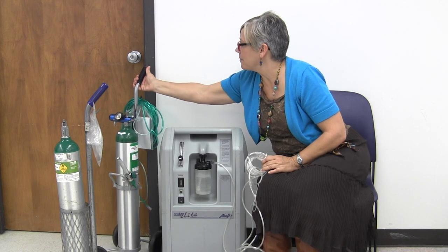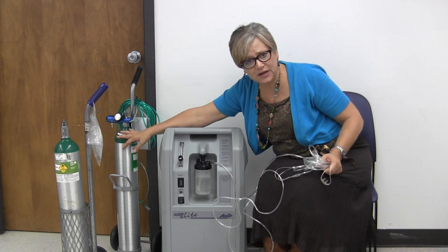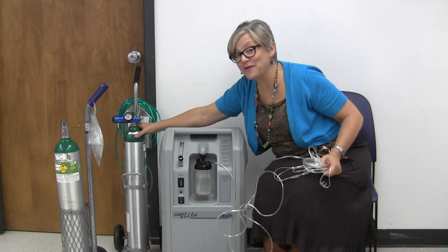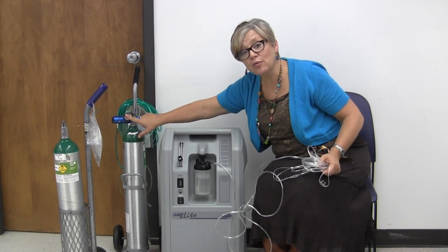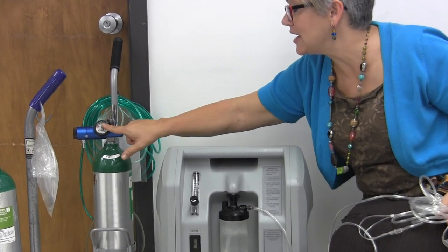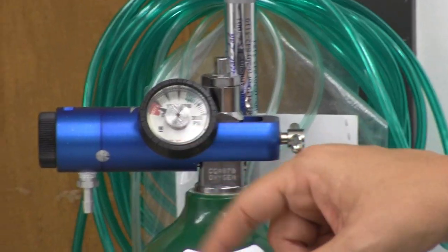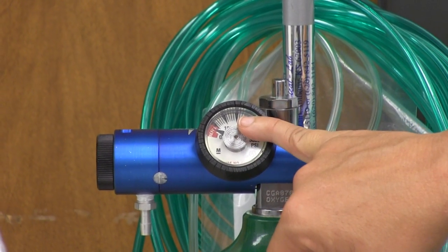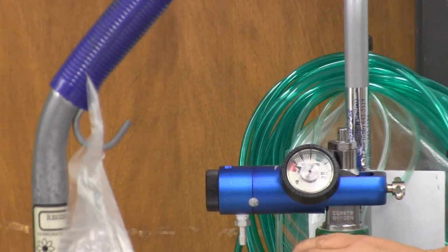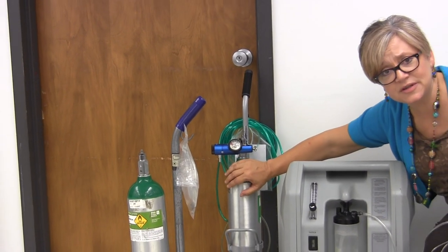Another thing I wanted to talk about is e-tanks. I'm sure a lot of you use e-tanks when you're going places with your residents. They're very heavy, as you know. Know your flow rate and make sure — test it, turn it on and see how much pressure is in there before you head out. Don't head out on a big trip with only a quarter of the oxygen left and a four-liter flow rate — you'll never make it. These are missiles. Don't just throw them in the trunk and let them roll around. They need to be secure. They're very dangerous if you don't take care of them correctly.